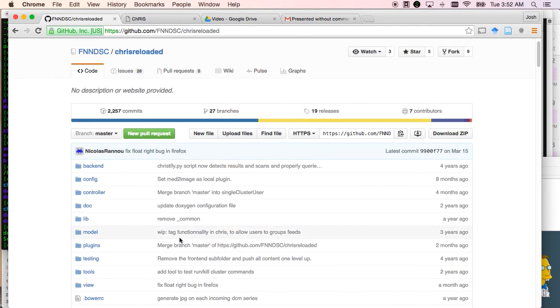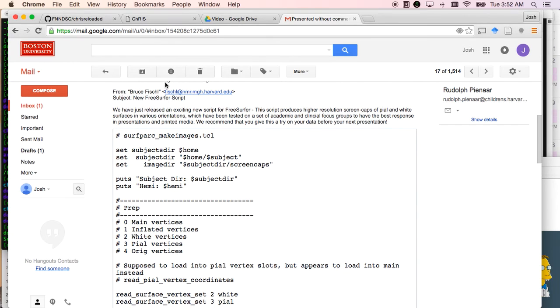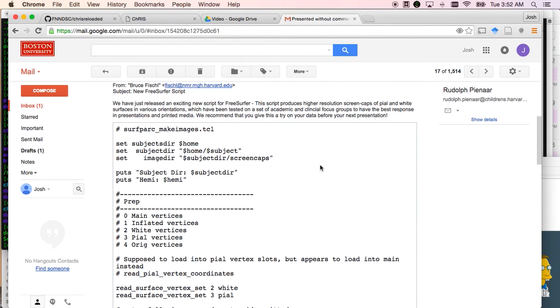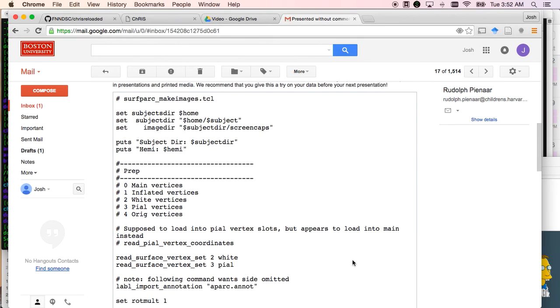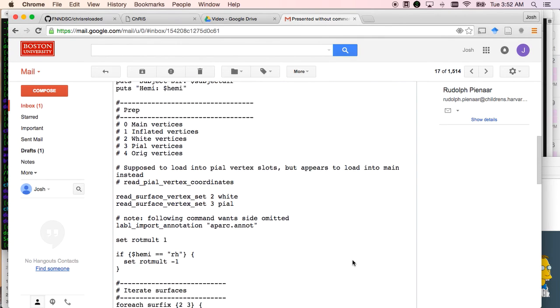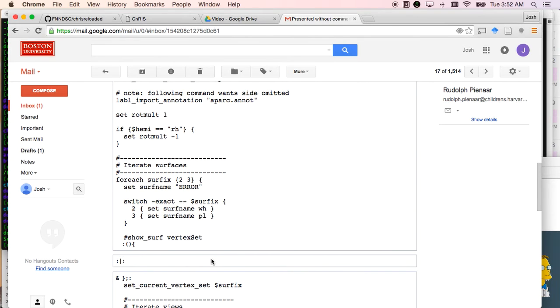Now, as it happens, you don't even have to necessarily be able to get access to the system directly. Emails are easy to spoof, and it's not hard to imagine somebody who seemingly comes from a legitimate internet address gives a researcher who's not so familiar with the command line a seemingly innocuous script that somewhere down the line has hidden some real problems.